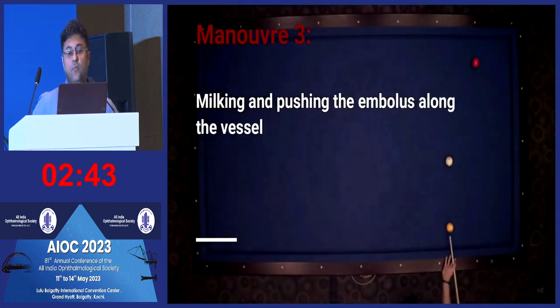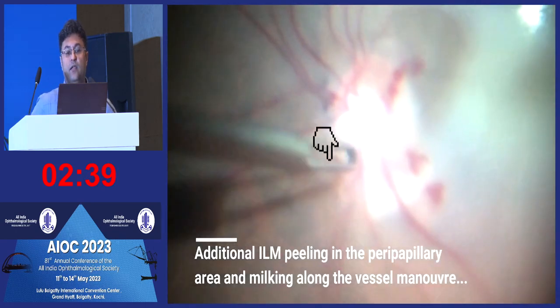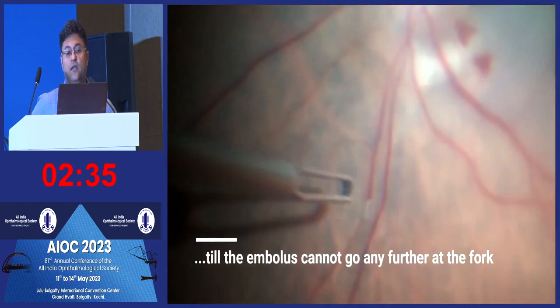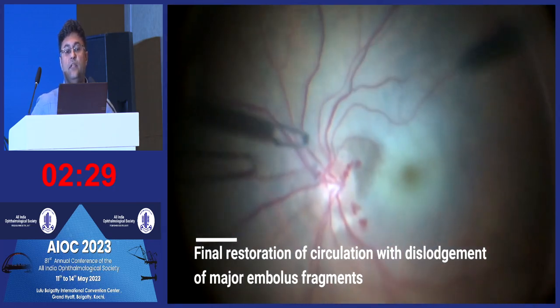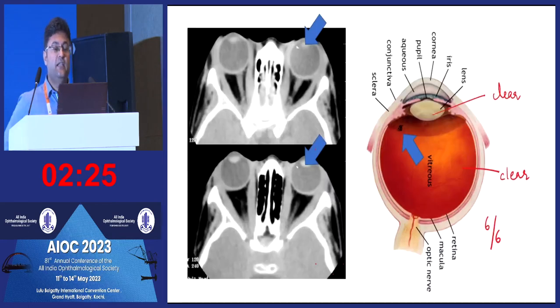So the third maneuver is actually milking the embolus along the artery. If it does not come by nudging, all you need to do is press on the artery a little bit and it comes away. This is a cigar-shaped embolus and it won't go further because it's caught at the fork. You see that the retina is well perfused now. Visual acuity improved to 6/18 in this patient.